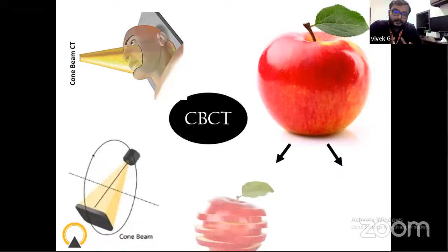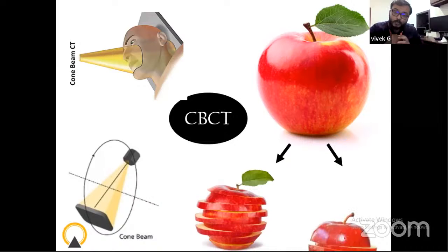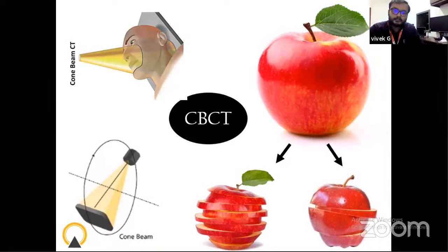From that full apple, with the help of computers and software, you can go in for orthogonal cuts like the axial, coronal, and sagittal. And the additional possibility from such an image is that you can cut in any way that you want, not just your orthogonal axial, coronal, sagittal cuts, but you can also go for other cuts like multiplanar imaging and oblique cuts.